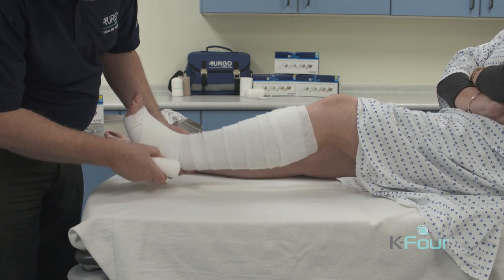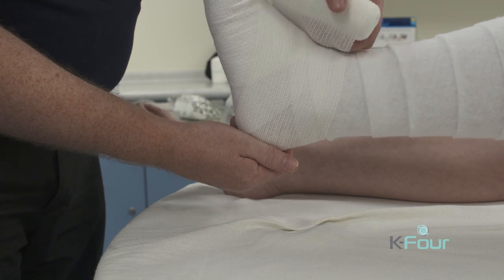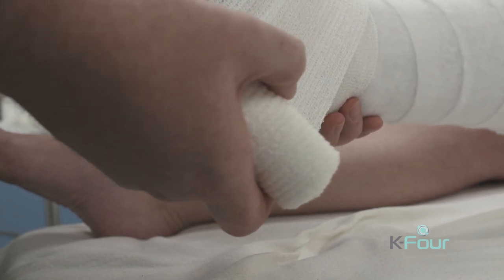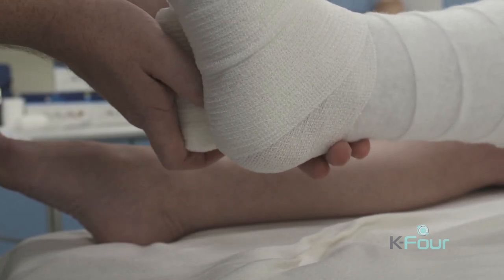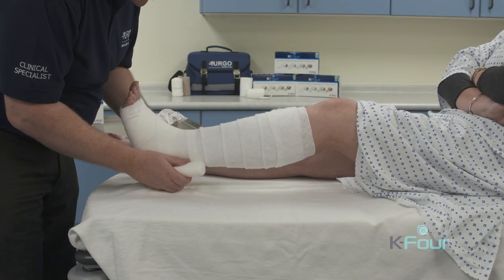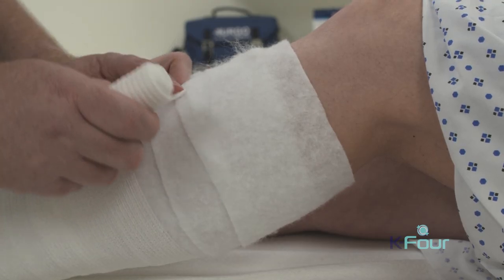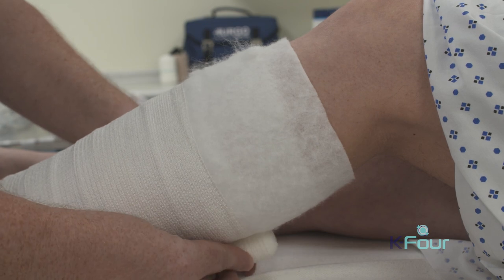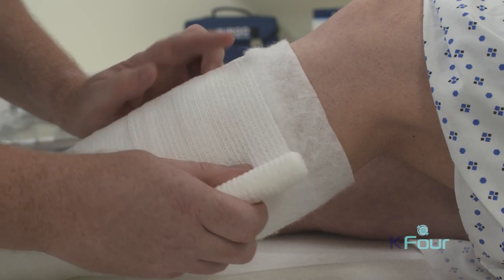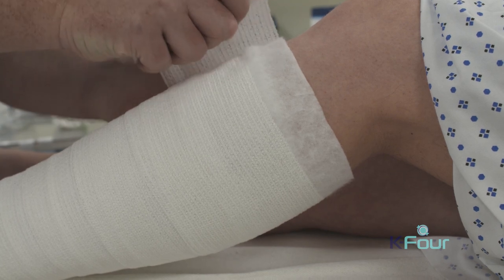We do our ankle lock here over the top of the foot, close the window underneath, and then lightly roll the bandage with enough tension so that it grips the limb. We do this at a 50% overlap to ensure two layers of K-Light on the limb.